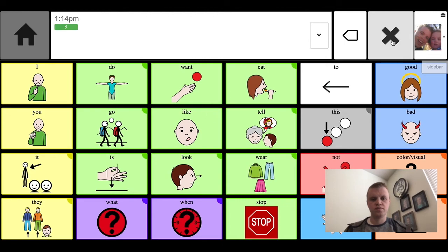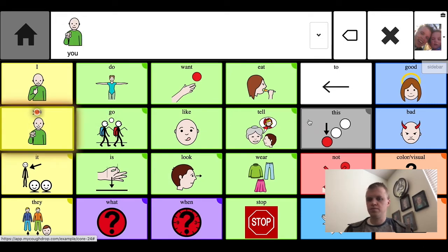We'll be continuing to add additional alternative access methods in the future for things like joysticks and keyboards and hand position pointing even, but you can start using what's there today.